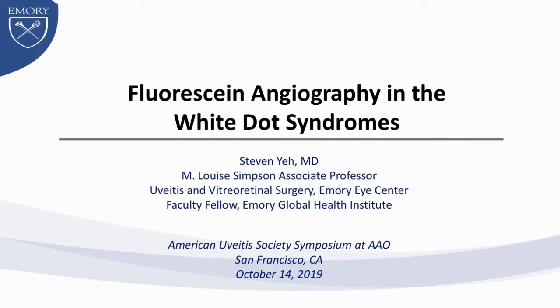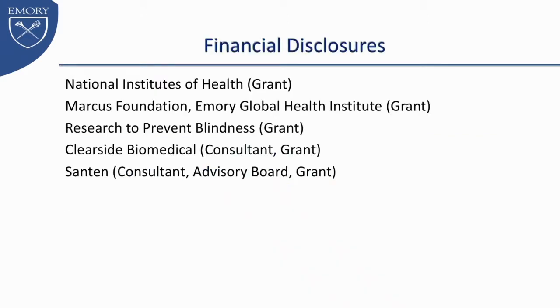Thanks again to the AUS Executive Committee for the opportunity to present to you on fluorescein angiography in the white dot syndromes. I'll be going over and reviewing some of the concepts that we haven't yet covered with respect to the clinical management of these conditions in the context of fluorescein angiography.